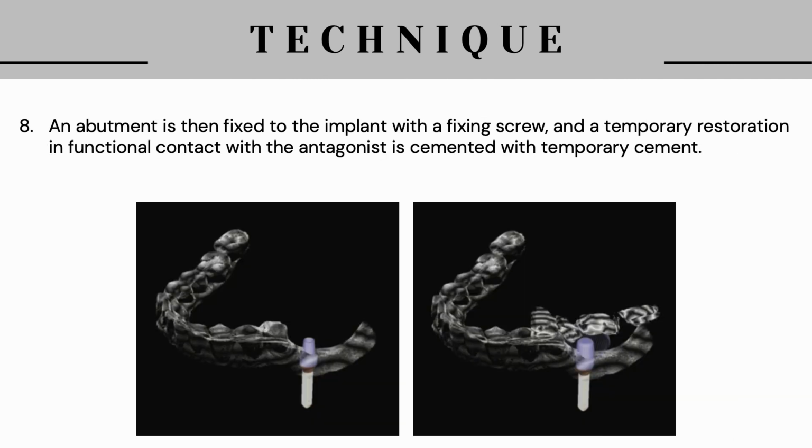Last, an abutment is then fixed to the implant with a fixing screw, and a temporary restoration in functional contact with the antagonist is cemented with temporary cement.